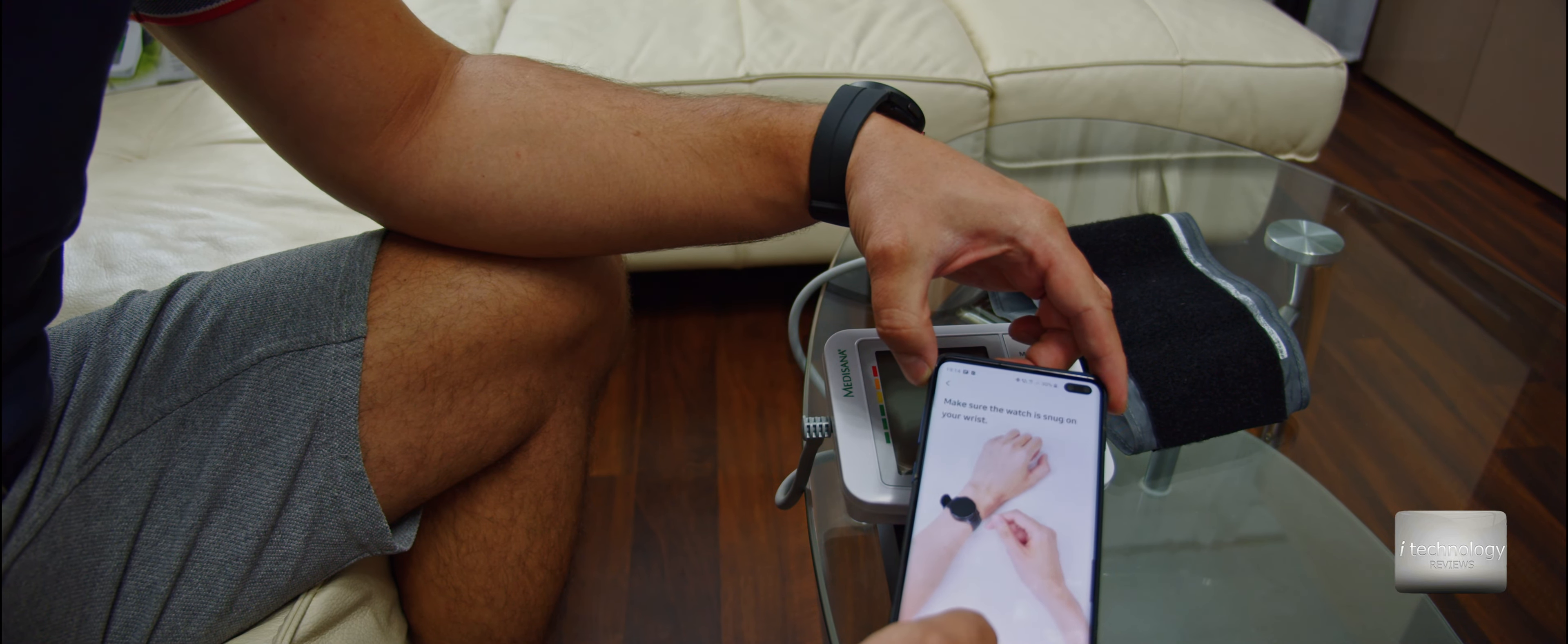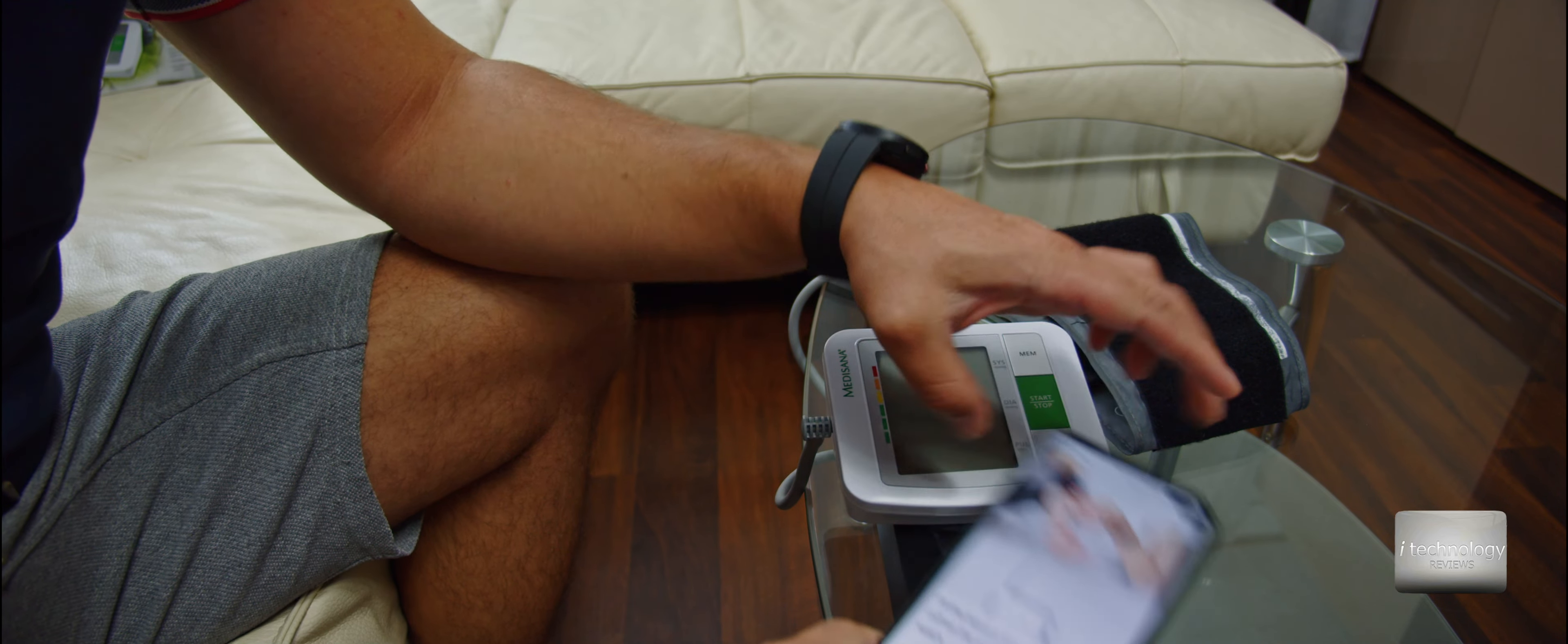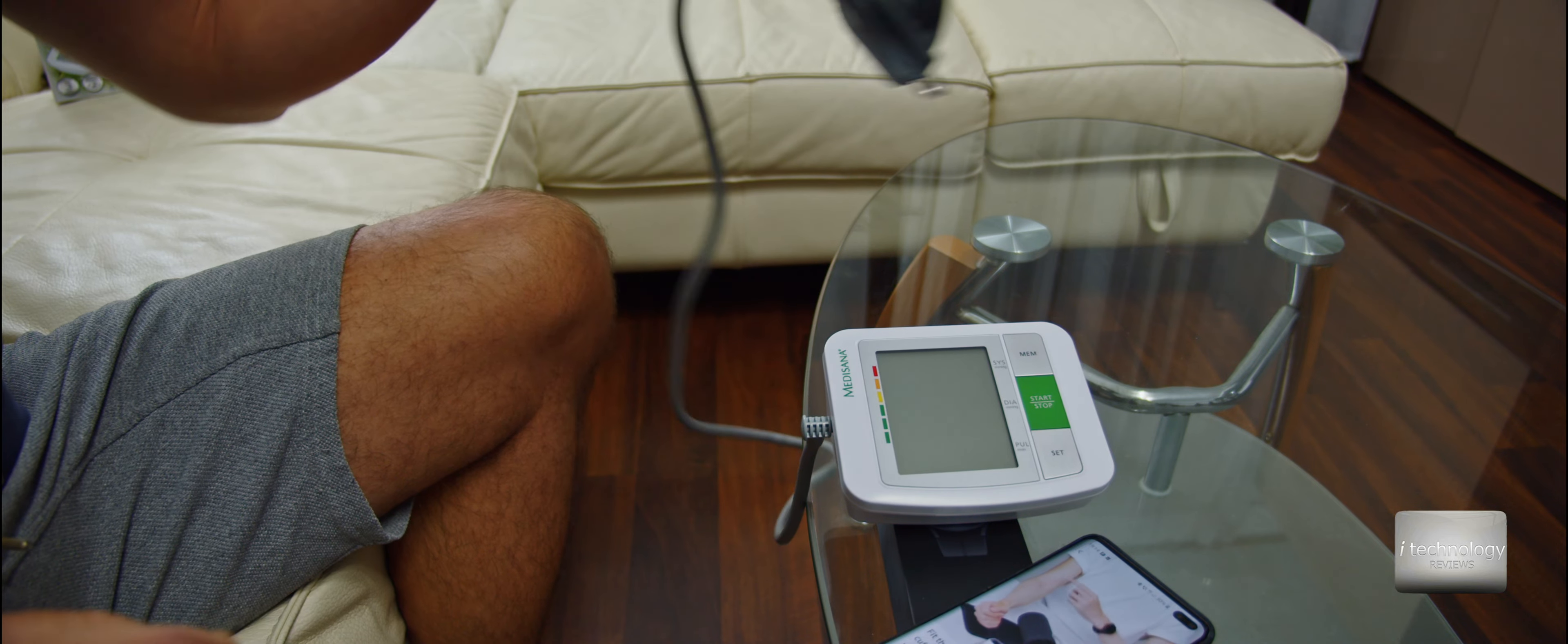To do this calibration, make sure the watch is snug on your wrist, so it's got to be quite comfortable but a little bit tight on the smartwatch, just to take the pressure. Fit the blood pressure monitor cuff on the arm opposite your watch.